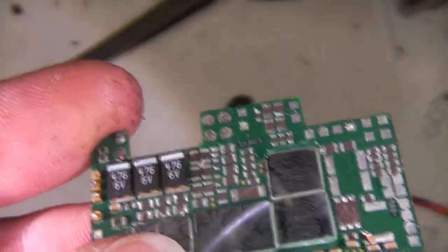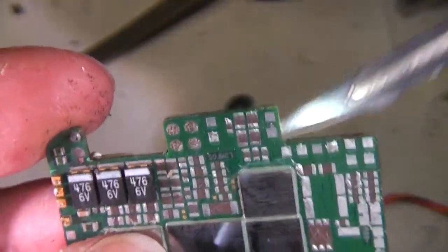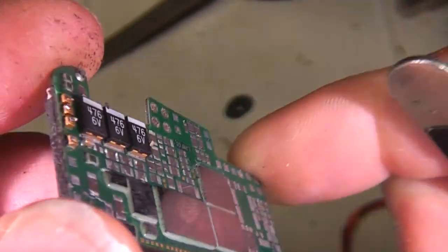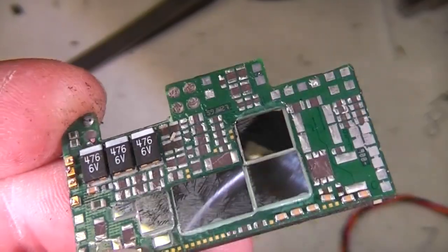an extremely high density. And certainly I did try using hot air to soften up this lacquer and soften the potting compound, but that didn't really work. Obviously it's unsoldered all these chips in the process, but it seems to be a very, very tough bit of circuitry, so I think it might need a bit more sustained attack.